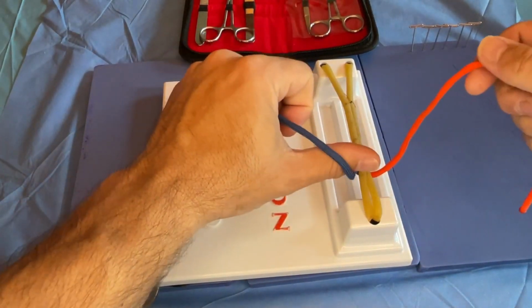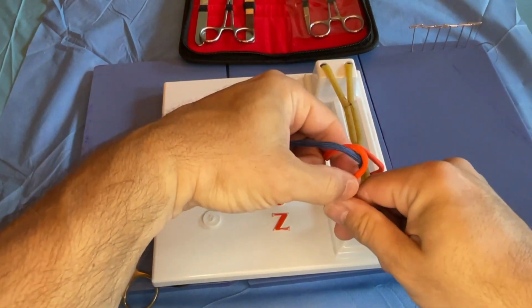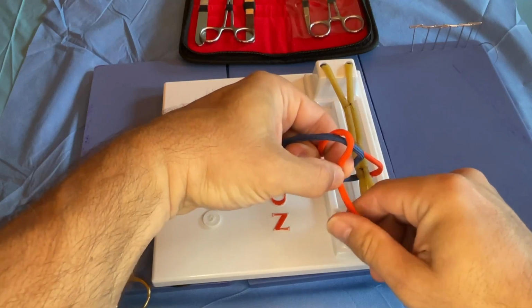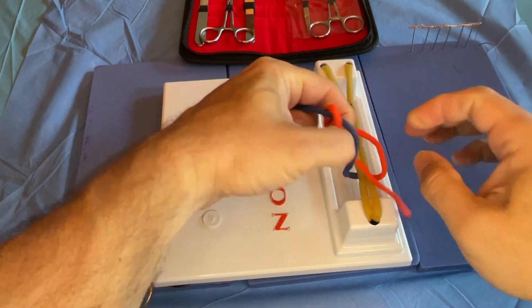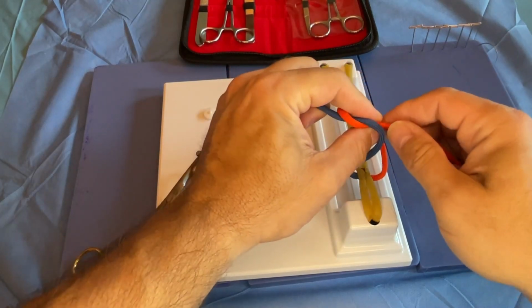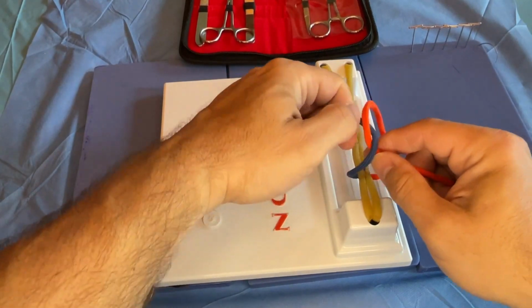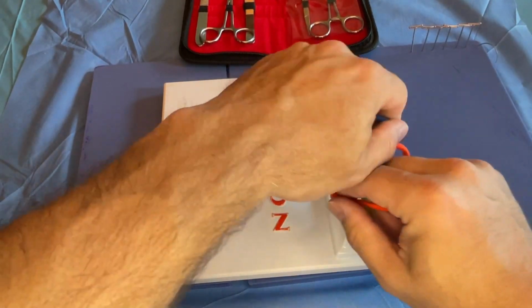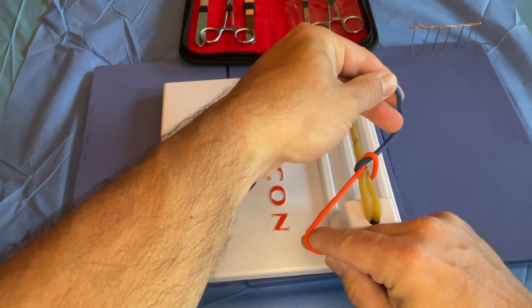What I do is I start off over the thumb. So again, we create the loop there kind of around my thumb, swing through at the finger, pinch between finger and thumb, swing it through this way, grab it here. So the free end here, the tail of the suture, is always in control. We're always holding on to it one way or another. And then what I do with that first wrap around my thumb, and when I swing it through, I don't cross my hands over, but I do kind of pull opposite like that.